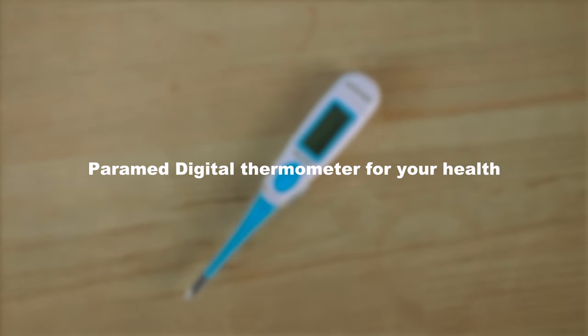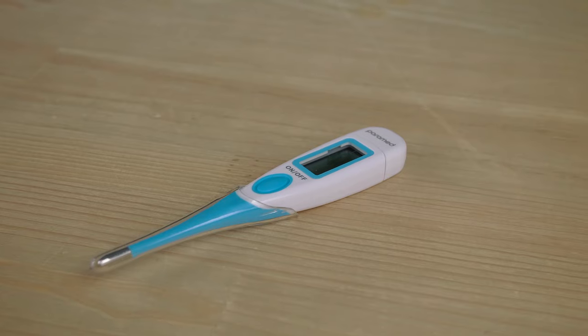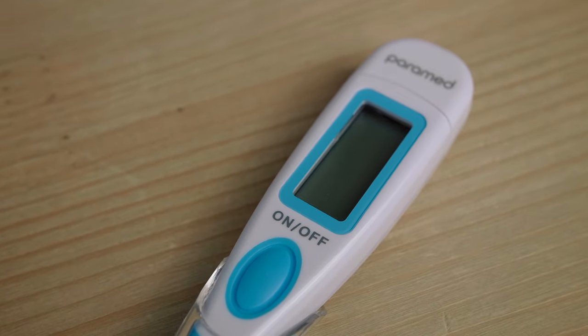A digital thermometer from Paramed is a universal device for accurate body temperature measurement. It works on three modes and measures temperature orally, rectally, and axillary.